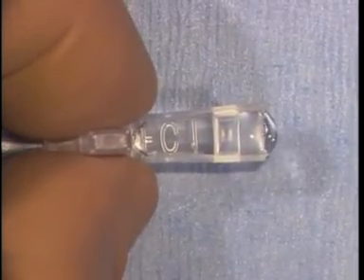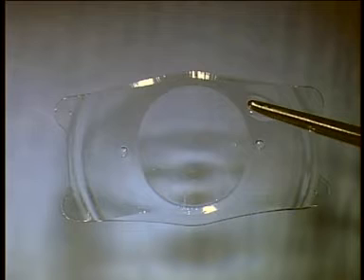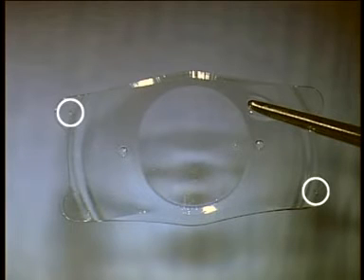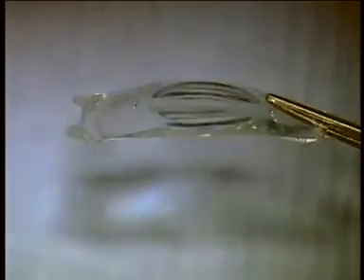Set the cartridge aside. Using a forceps, gently lift the ICL from the vial by carefully grasping the lens haptic. Inspect the ICL under the operating microscope to identify and verify the correct orientation of the lens. The footplate marks on the leading right and trailing left haptic indicate that the correct, convex side of the ICL is facing up.